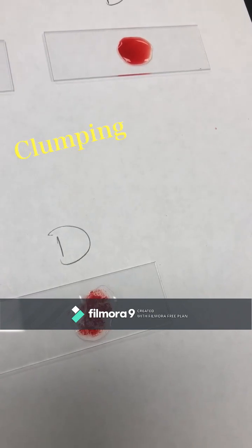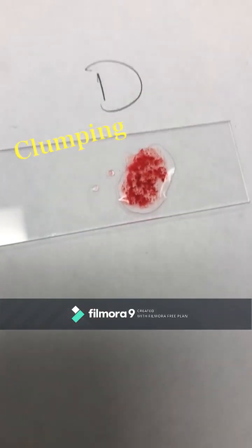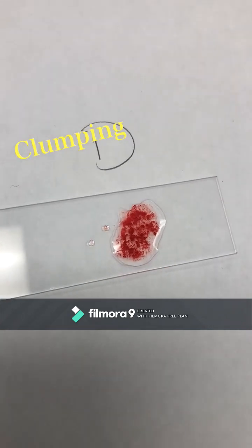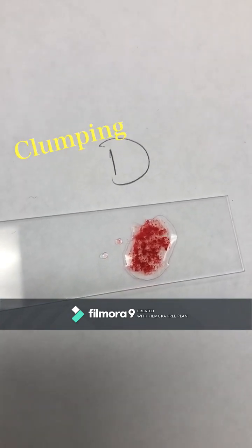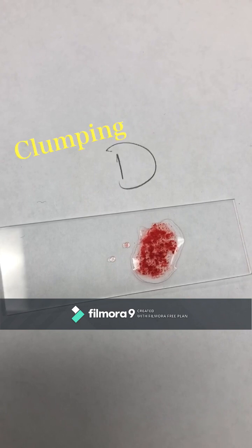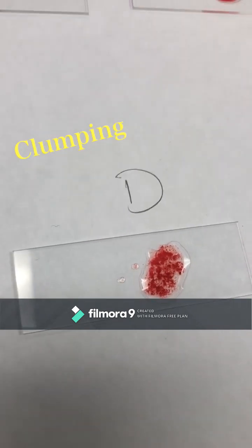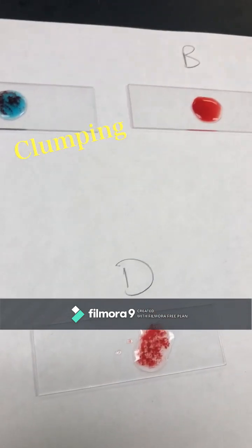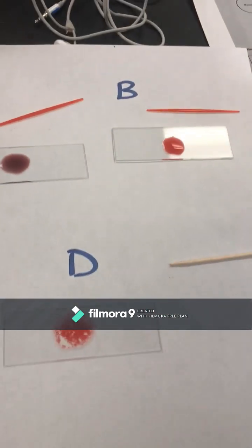No clumping on B — we're the same. And then A positive, right? Yes, so what's your blood type? A. What's your RH? Positive. So you are A positive. Good for you.